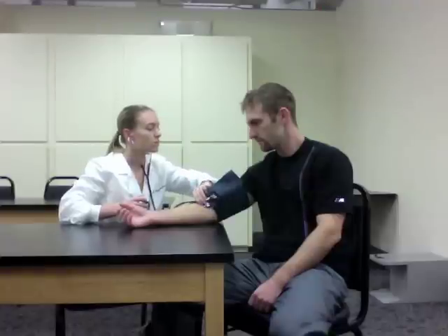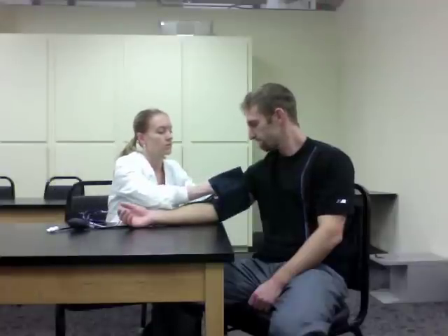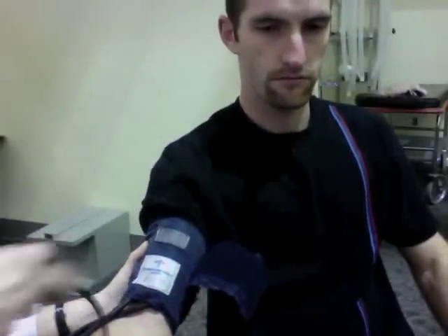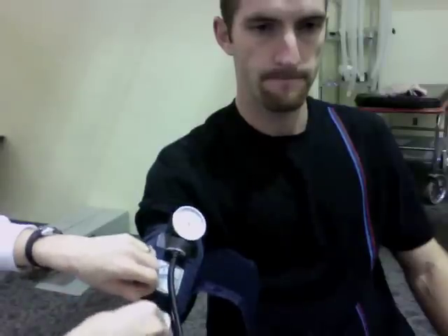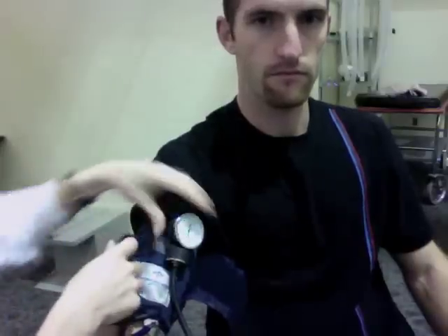The observer should then place the stethoscope on the brachial artery so that it is not too firm to interfere with blood flow and not in contact with the cuff to cause audible interference. The cuff, once inflated approximately 30 millimeters of mercury above predicted systolic pressure, should then be opened at a rate of 2 millimeters of mercury per second. At this stage, the observer must listen out for the first Korotkoff sound and note the accompanying pressure as the systolic pressure. The diastolic pressure occurs at stage 5, where silence commences, although many argue that stage 4 is the more appropriate reading. Stage 5 is defined as the moment sounds end, however, so this is the most accurate reading of diastolic pressure.